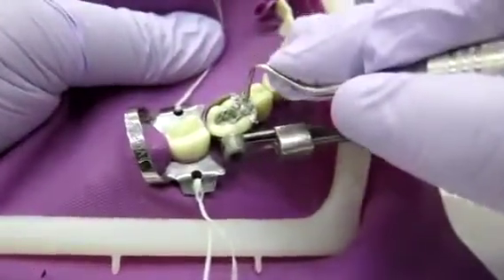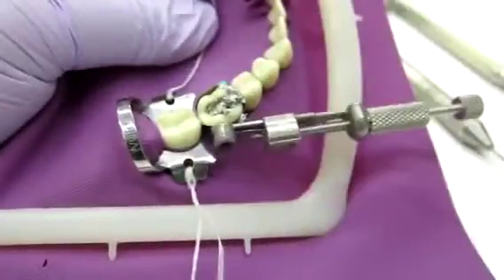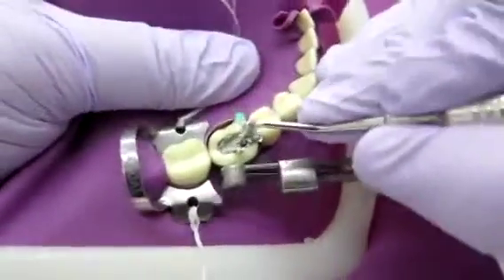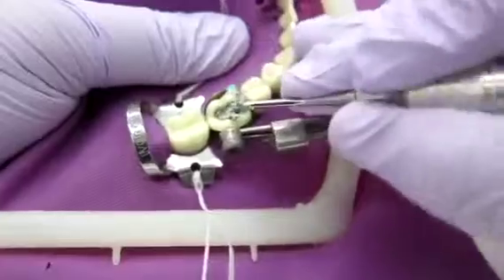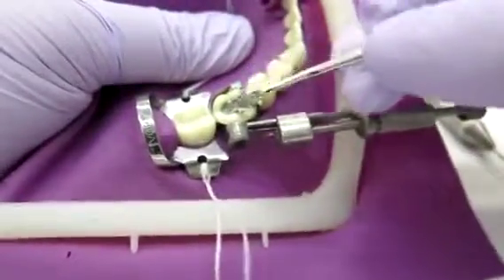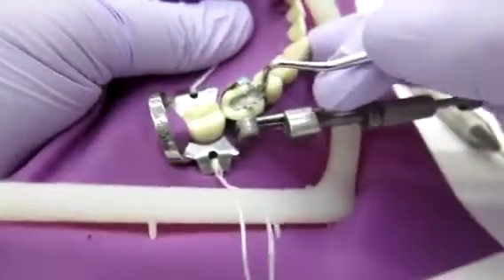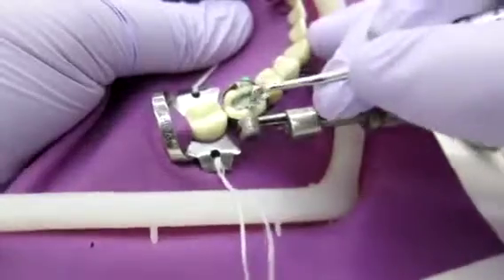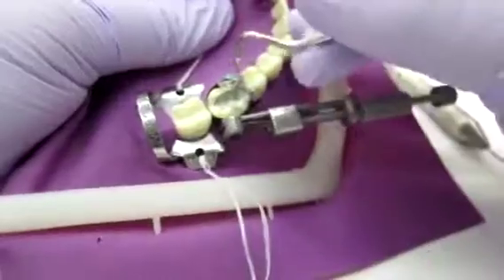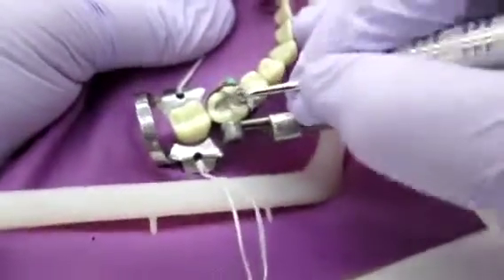I'm focusing all of the amalgam where the marginal ridge is first because I want that to set first. I'm moving up to a bigger condenser because I feel like the small one is just pushing things around. Once your marginal ridge is filled up, you're going to start working on your occlusal. And remember, with amalgam, you want to overbuild — that way you have extra material to work with and carve out.